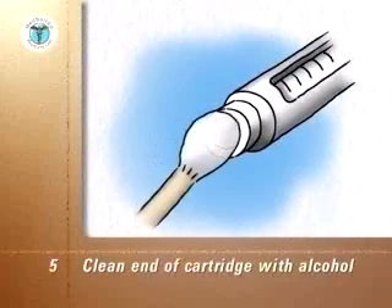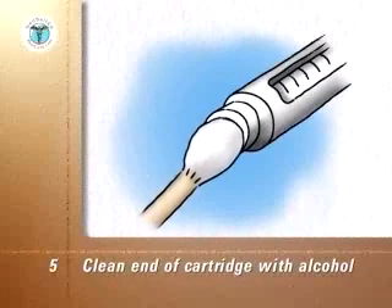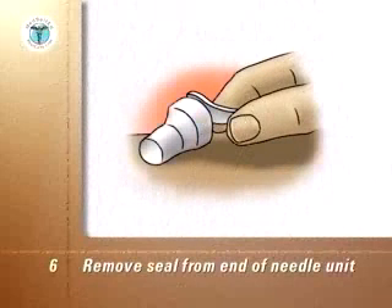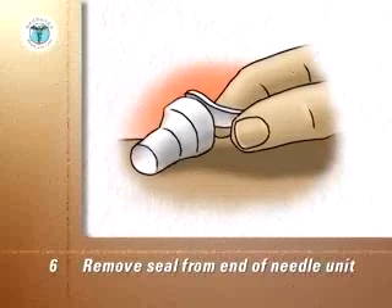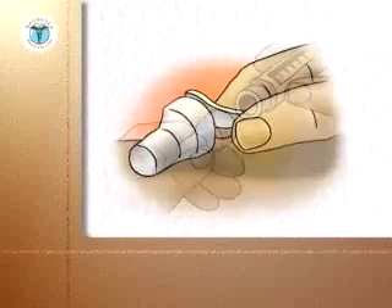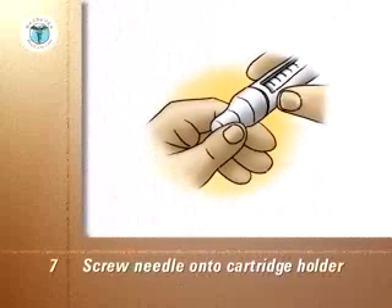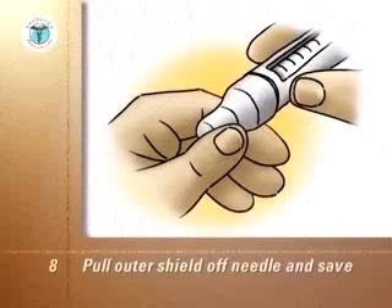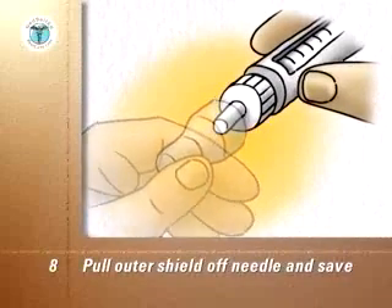Clean the end of the cartridge holder and the projecting cartridge with an alcohol swab. Remove the seal from the end of the new needle unit. Don't touch the exposed needle or allow it to touch any other object. Screw the needle unit onto the end of the cartridge holder. Pull the outer shield off the needle — do not throw it away, as you will need it later to remove the needle unit from the pen.